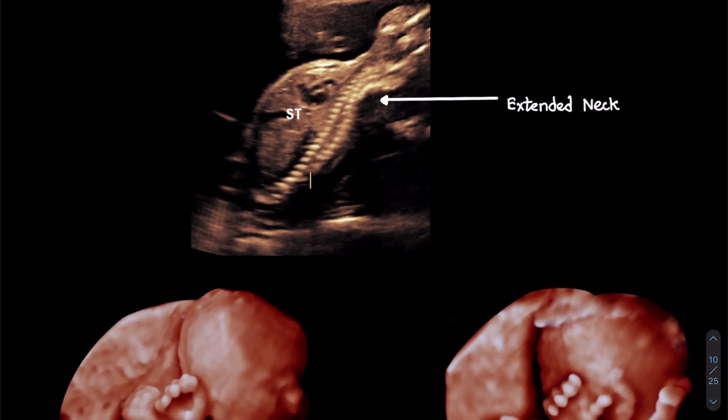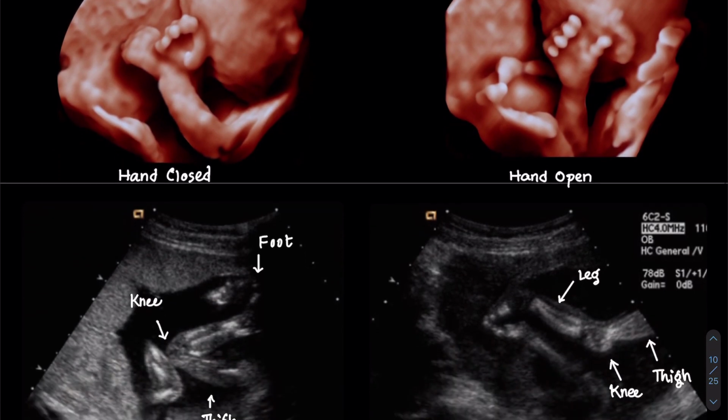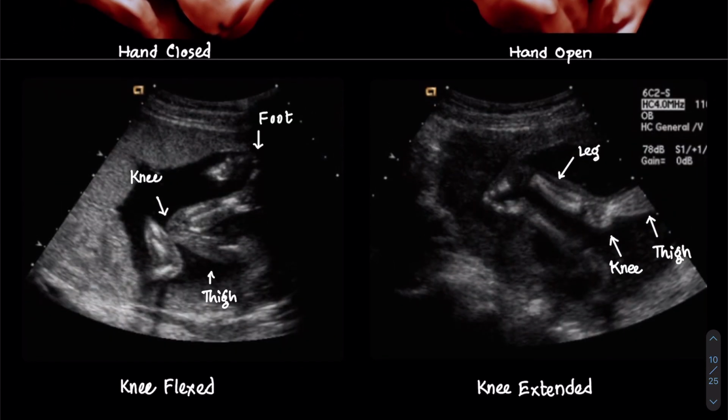Now on these 3D images, the baby is feeling shy to show us its face. You can see the closed fingers on the left and open on the right. Closing, opening, then again closing is counted as a single tone. So that's easy. You just need to see a single tone during examination period. Next, we can see a flexed knee on the left and sudden extension on the right.